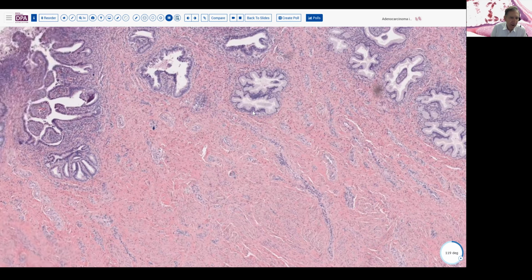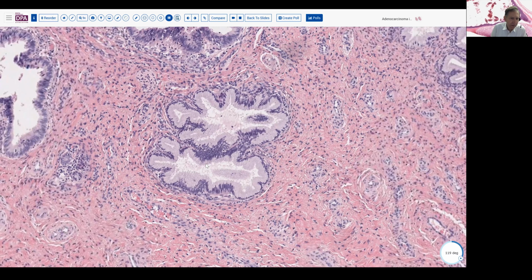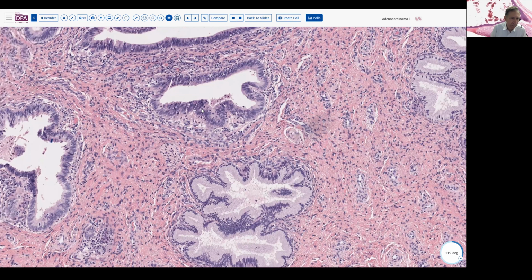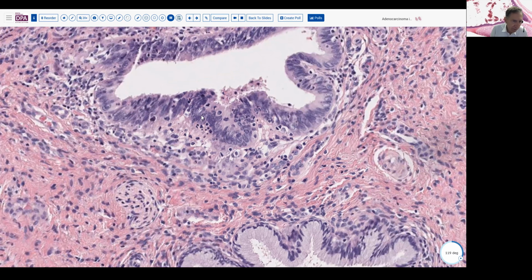So here are fairly normal endocervical glands, maybe a little bit of columnar hyperplasia. And then right next to it, a different morphology. And here we can see the classic features: some karyorrhectic debris, and here are these mitoses up near the lumen. Again, there's also some inflammation here.